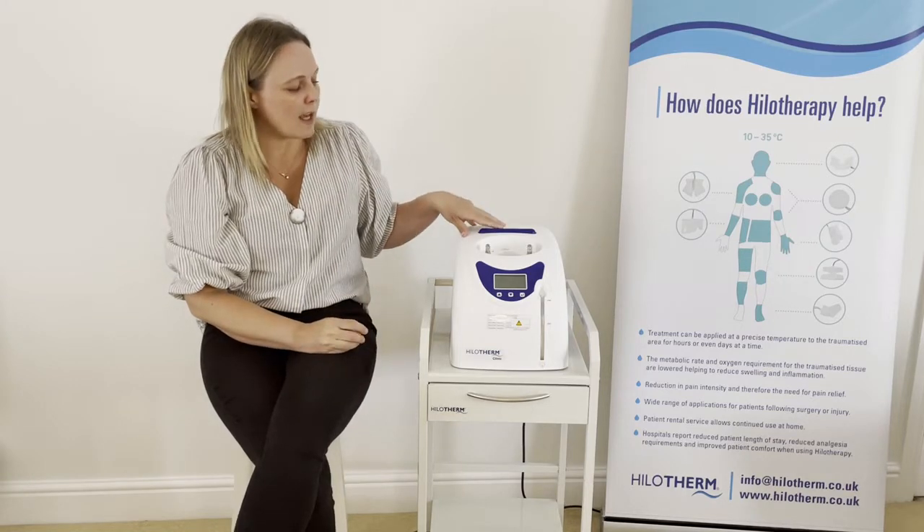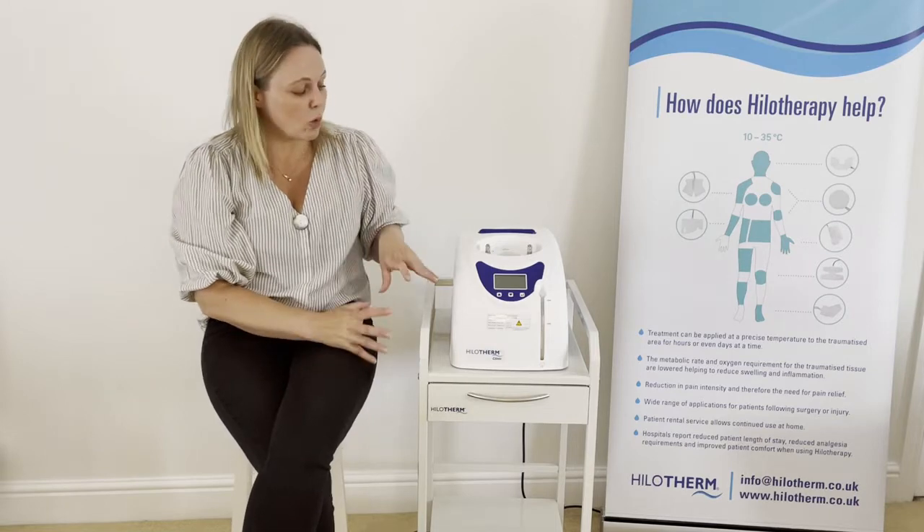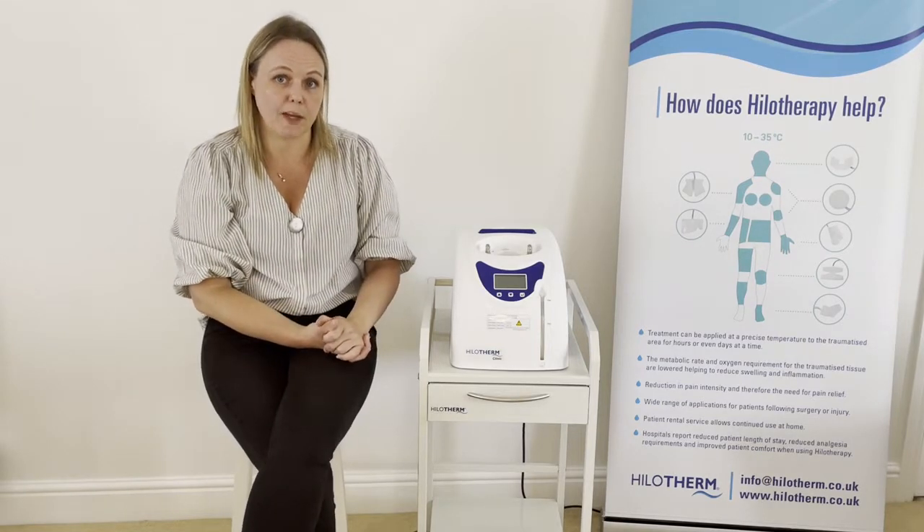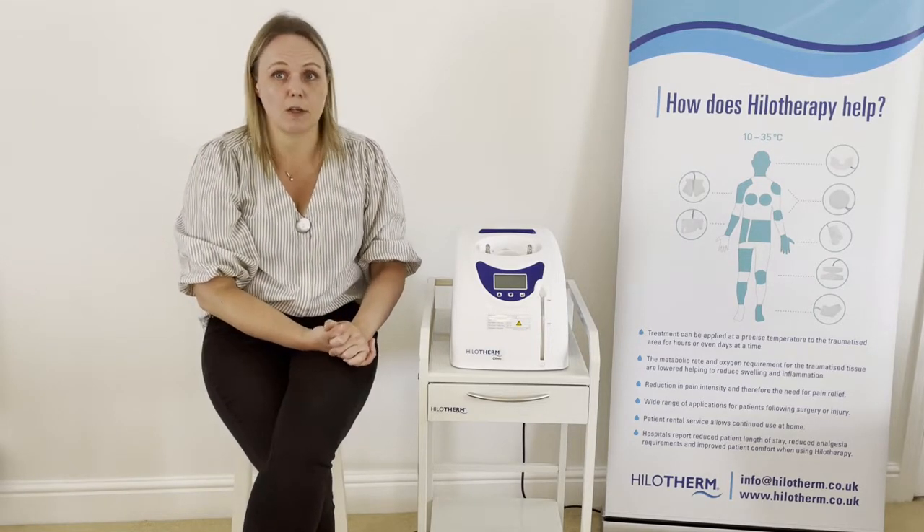The machines contain two litres of either sterile or distilled water. That water is then cooled to a specific temperature and then pumped around a cuff which is fitted to the part of the face or body that is needing treatment.